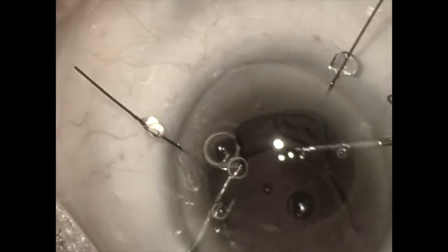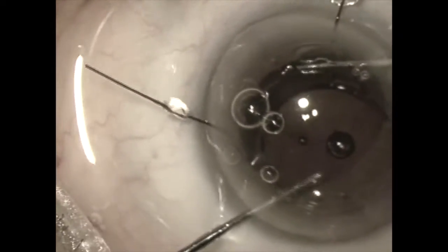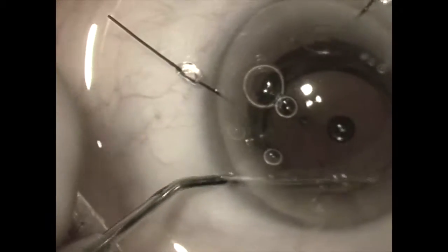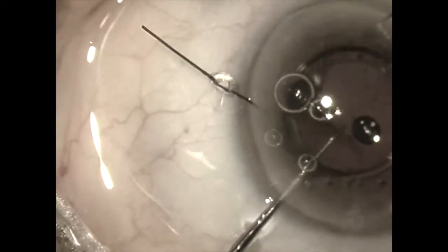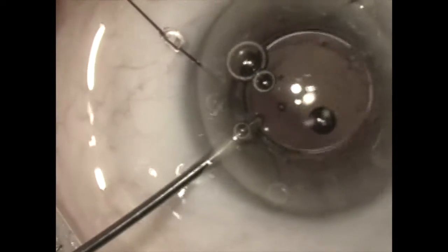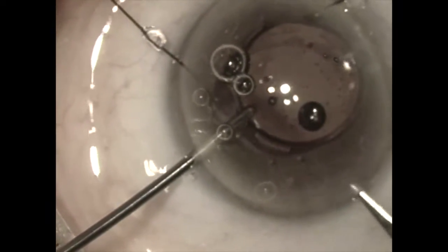Once the lens is completely brought up into the anterior chamber, we can now isolate it with some viscoelastic and proceed to cut it in half. Here we are going to grab it with an MST micro forceps and then cut it with an MST 19 gauge Packer Chang scissor.